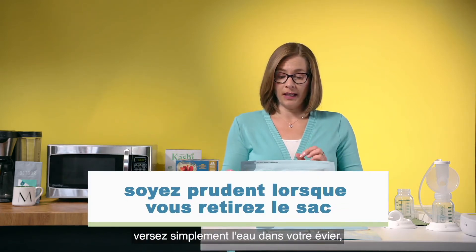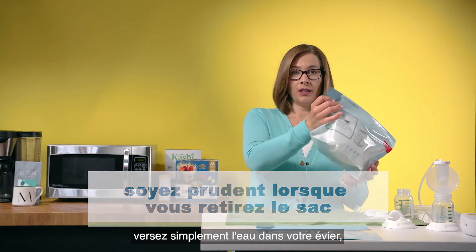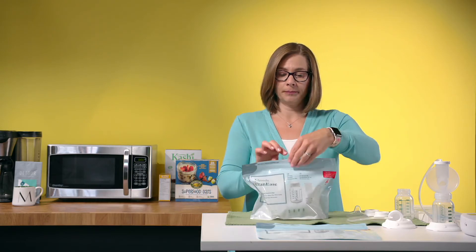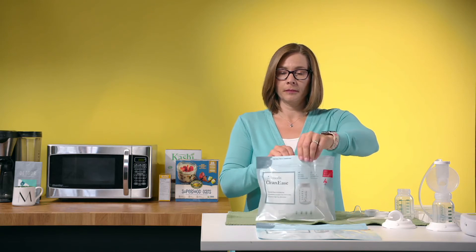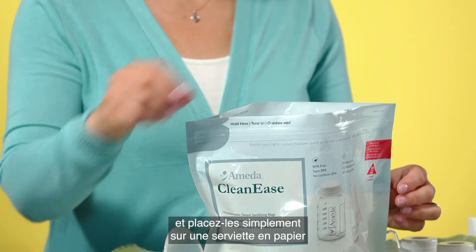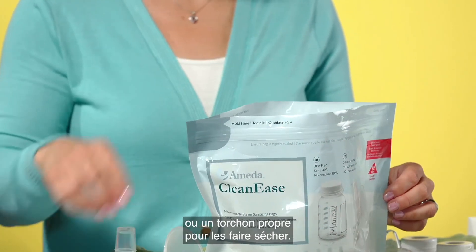When your microwave is done, simply pour the water into your sink, empty it out, and then carefully open your bag. That's all it is, and then take your parts out and just place them on a paper towel or a clean tea towel to dry.